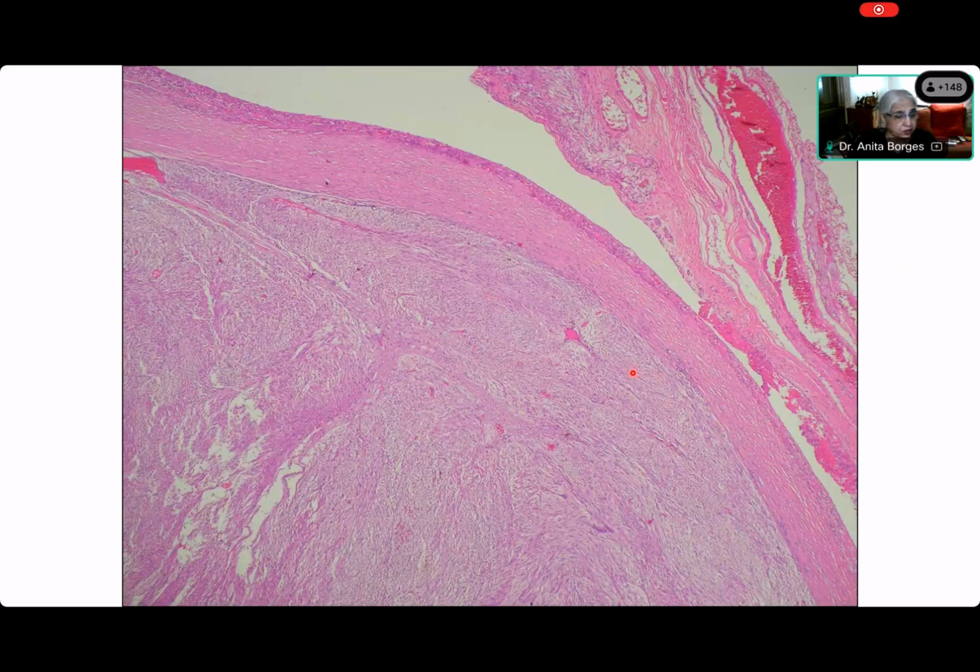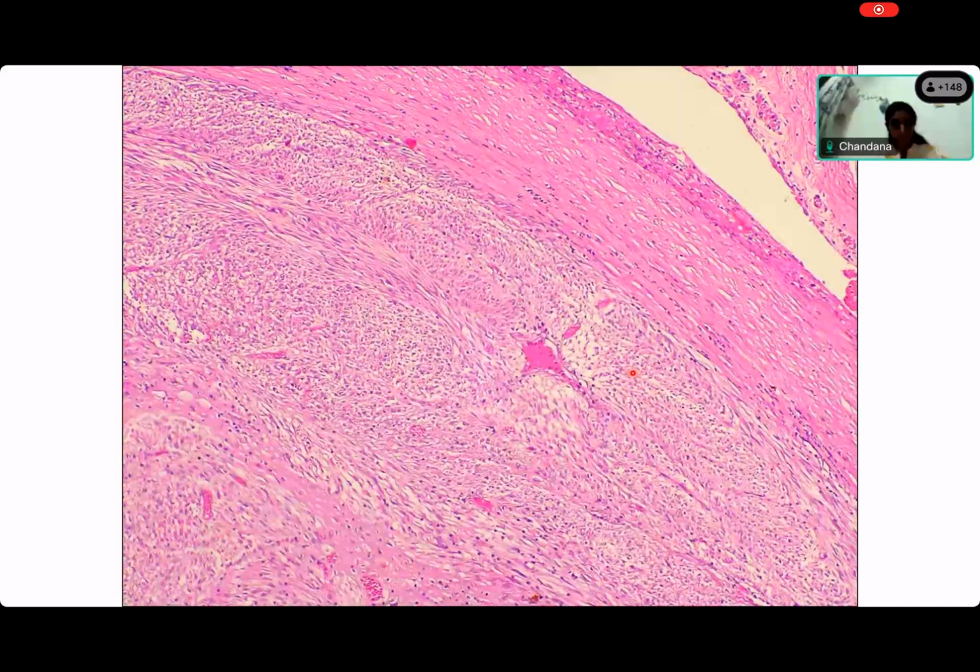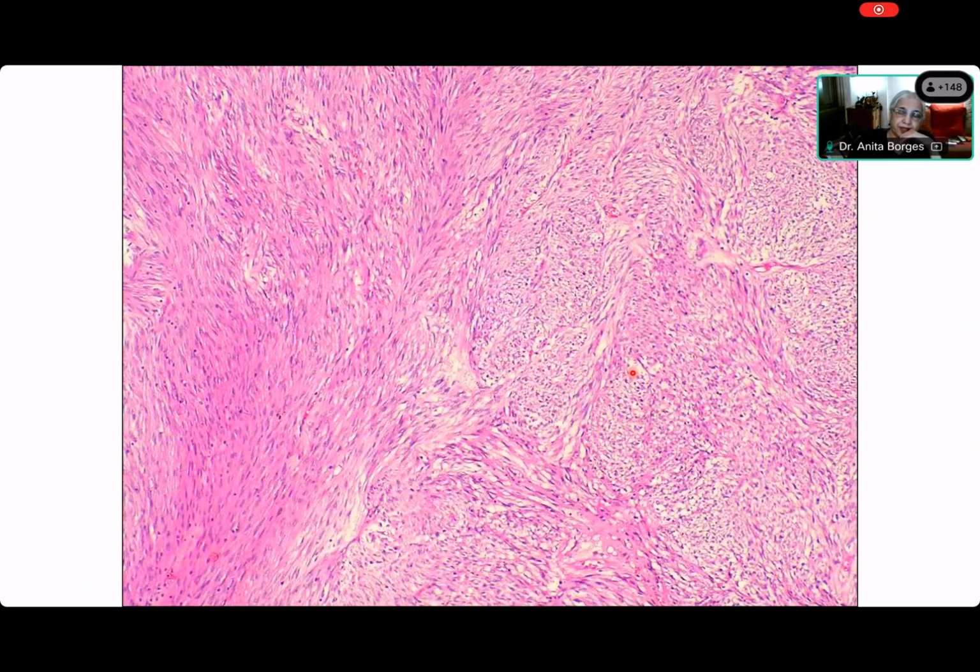Is this a spindle cell lesion, Chandana? Yes, ma'am, looking like a spindle cell lesion. It is a spindle cell lesion. You want to say anything about it? What is the pattern in which the spindle cells are growing? It's looking like a herringbone pattern. They are in fascicles, right? There really is no herringbone pattern. These are all cut obliquely or transversely, so they're not spinning off like ribs. So there is no herringbone pattern.